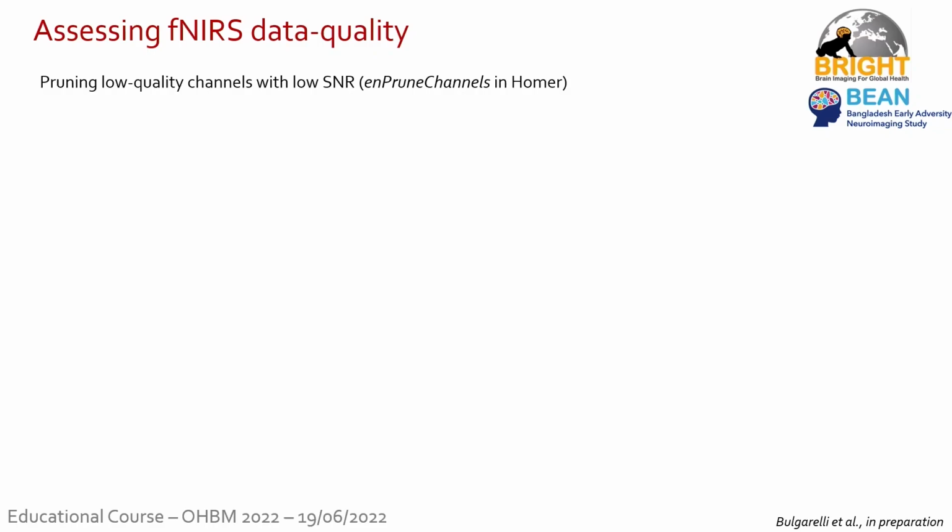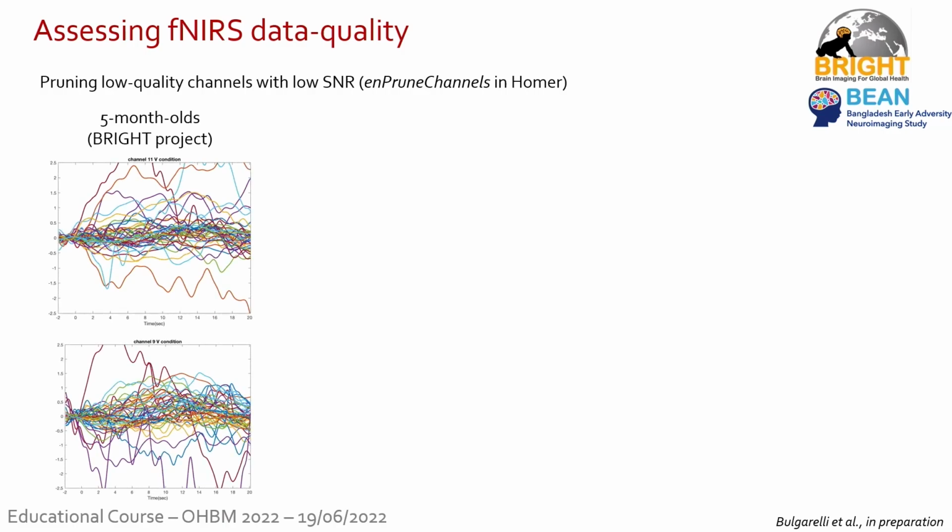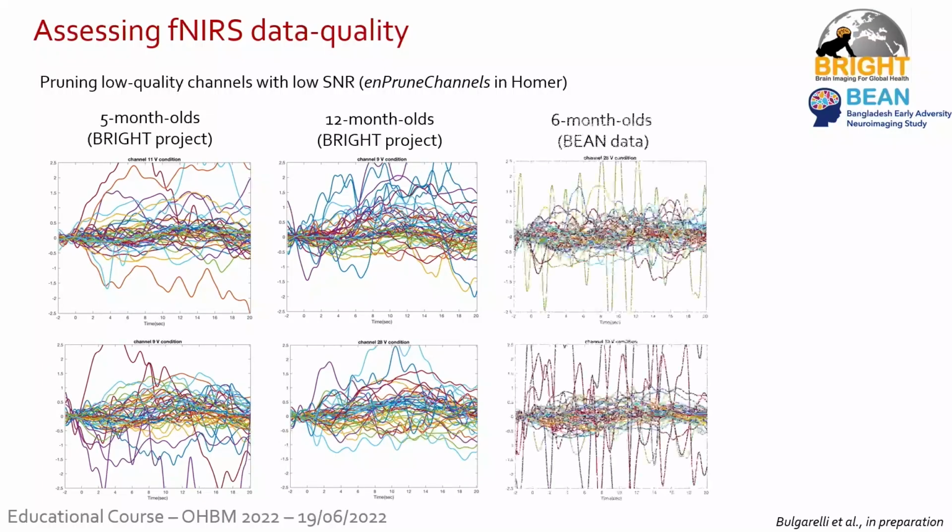Okay, so this was just a little bit about the analysis tool. Then I'm going to spend the very last few minutes to talk about a new tool that Luca Pollonini has been developing recently to assess fNIRS data quality, and I've been helping him to adapt his tool to infant data.